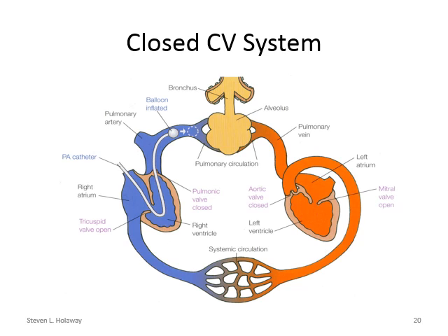The pulmonary artery catheter works simply because we recognize that our cardiovascular system is a closed system. Now we understand that we lose nutrients, we lose oxygen, and sometimes a little amount of fluid at the capillary beds. This all works because we can measure pressures based on fluids and how waveforms travel through fluids.